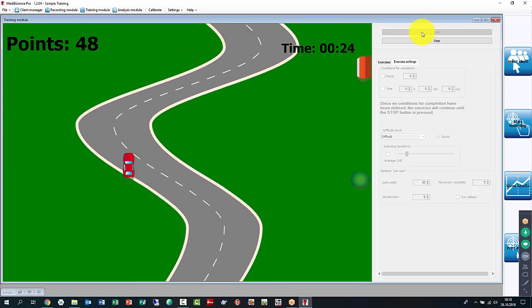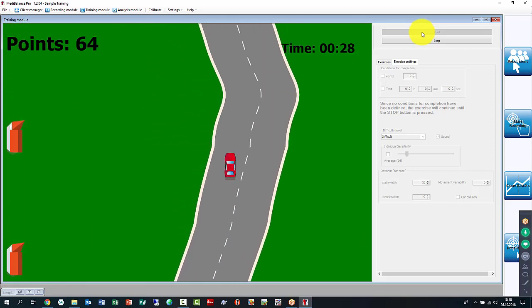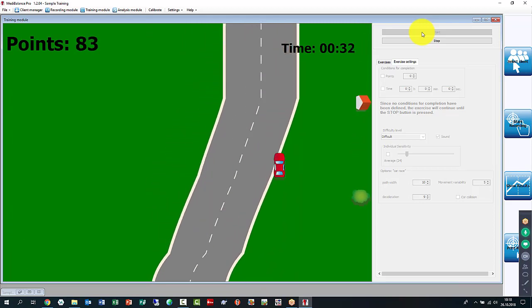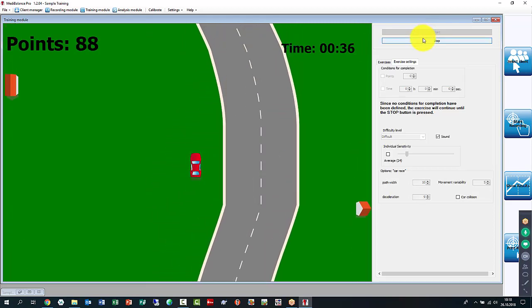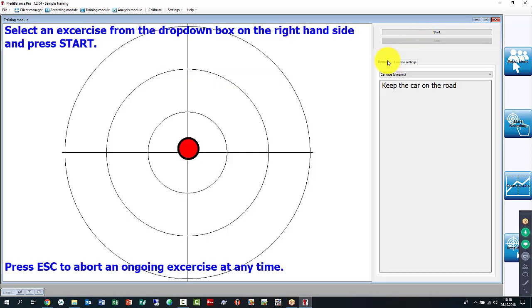Now this is already expert level. But as you can see, it's a doable process, just to give you an idea. Okay, I'm going to stop now. You're collecting a lot of points in short time here, and we stop. So here we take away people's reluctancy to lean forward and to actually shift left and right while doing so.